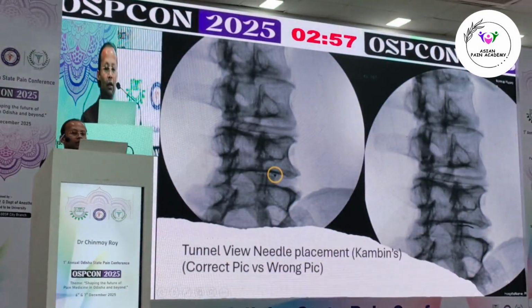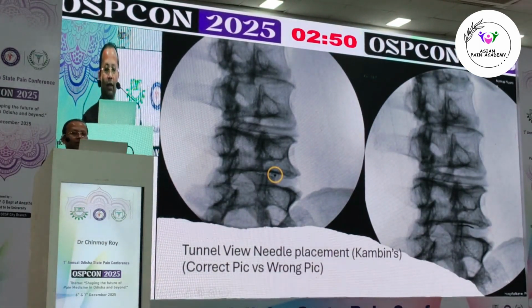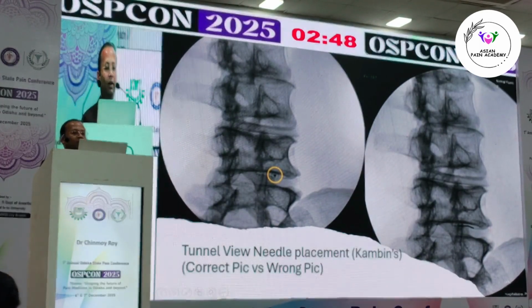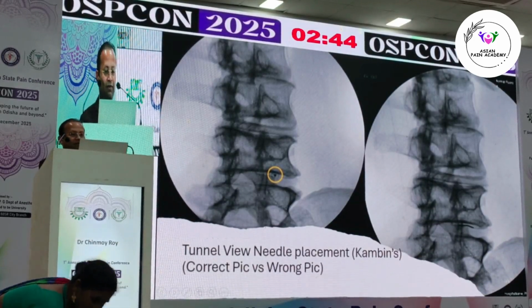While doing the procedure, if your needle is going like this, then you may think that you are going out of the foramen. So it should be a tunnel view like this, the left side picture.